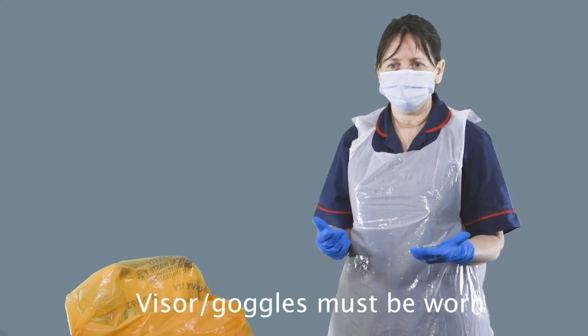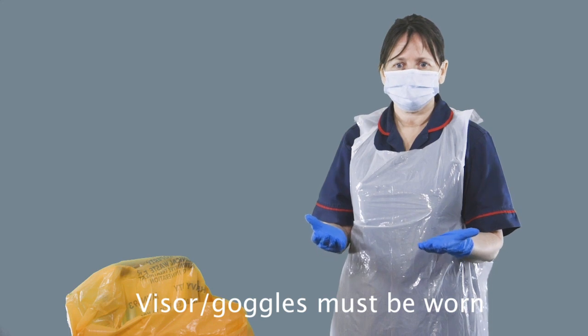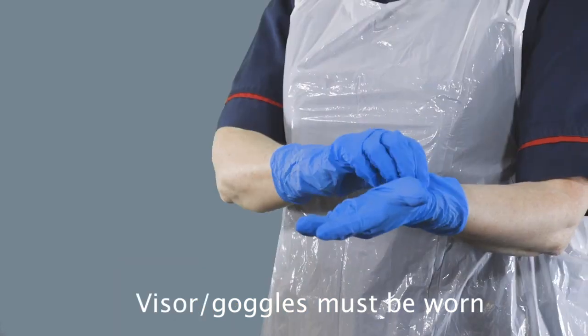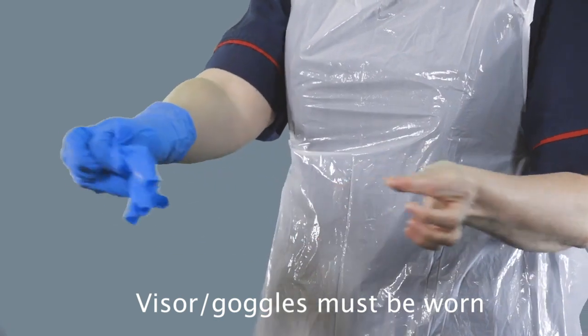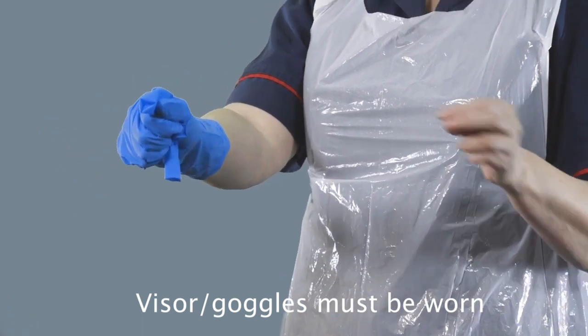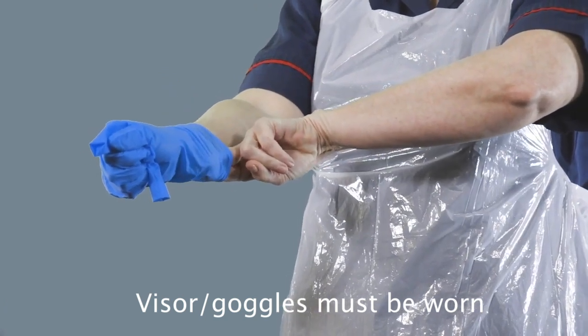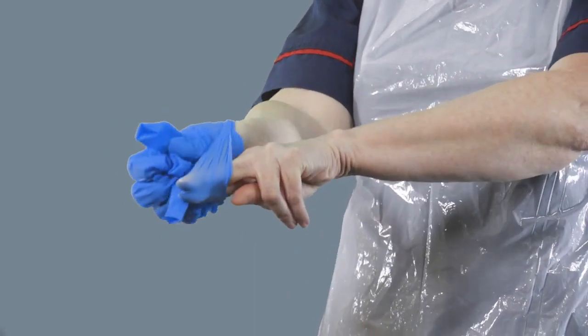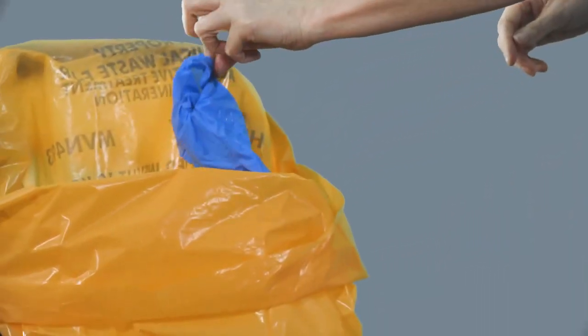Now you're going to take off your personal protective equipment — doffing. The first items to be removed are the gloves. Take the outside of the glove with your opposite gloved hand and peel it off. Hold the removed glove in the remaining gloved hand. Slide the fingers of the ungloved hand under the remaining glove at the wrist, peel off the remaining glove over the first glove, and discard into your orange bag.